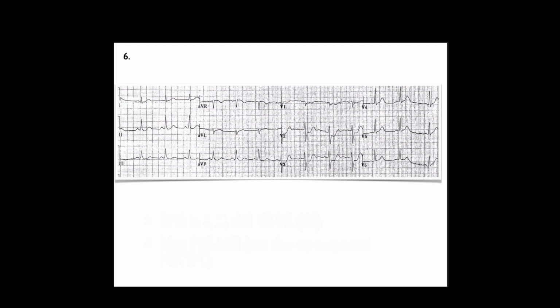So what's your best guess about why the ST depression is where it is? Possible posterior? Absolutely, an isolated posterior, definitely. It's got the whole shebang, the whole circus pony, right? But really, the ST depression is the most important part. There may be a little bit in 2. I don't quite see it, but I sort of see what you're talking about. But there is no other, so this is it.